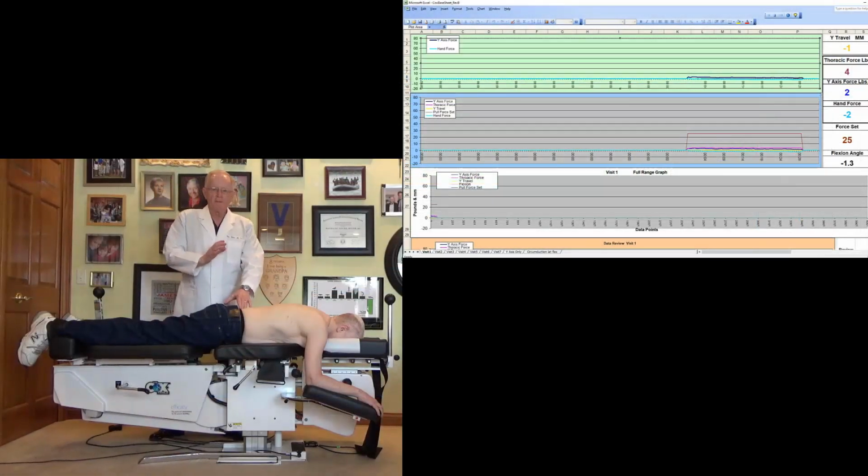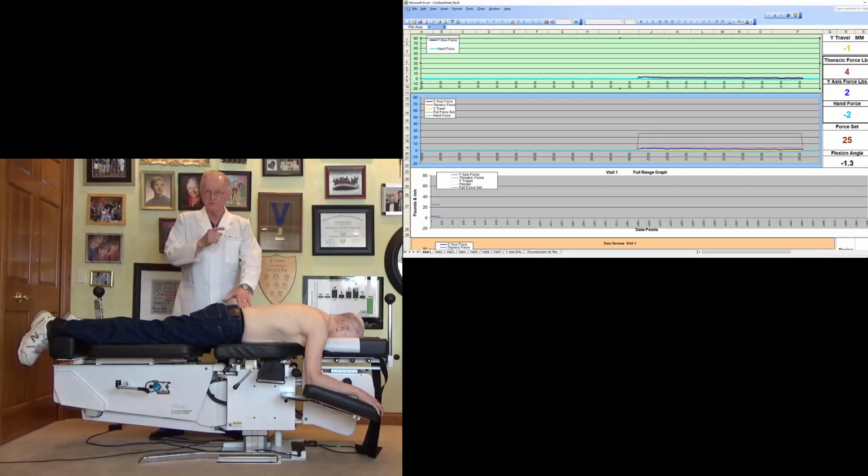When we apply manual or automated long y-axis distraction and mobilization to a spine, we use the least force that gives a positive clinical outcome, and also which produces what Wong, Beatti, Kuo, and Chung showed us: increasing physiological range of motion, dropping intradiscal pressure, stimulating circulation into the disc, and increasing nutritional supply to hopefully change some degenerative into regenerative changes. This patient has L4-5, L5-S1 disc degeneration.